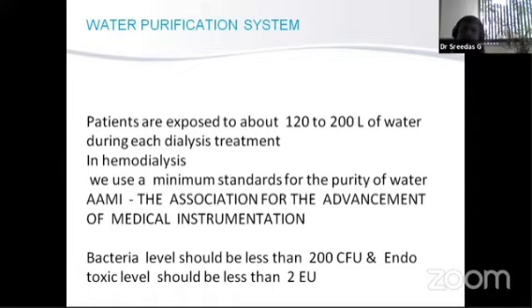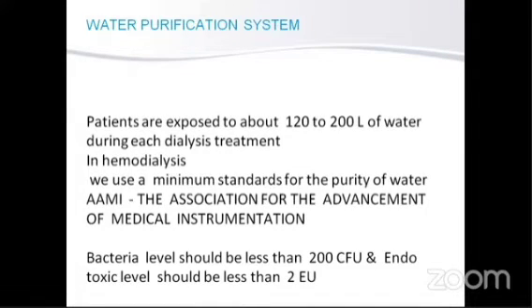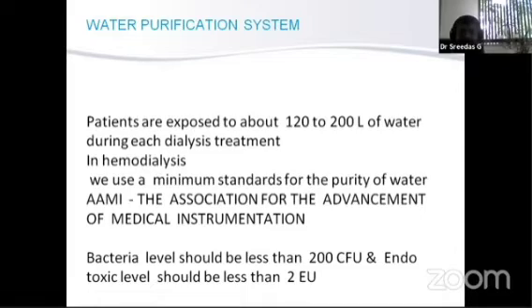So what is the importance of this water treatment? One thing is we should know that a person might drink 2 or 3 liters of water per day, and our gastrointestinal tract is the membrane that protects it. But for dialysis, in a session of dialysis, around 120 to 200 liters of water is being exposed against a membrane, and that should have a quality much superior to the potable water we drink.